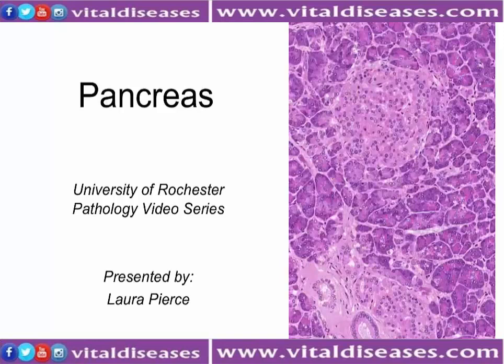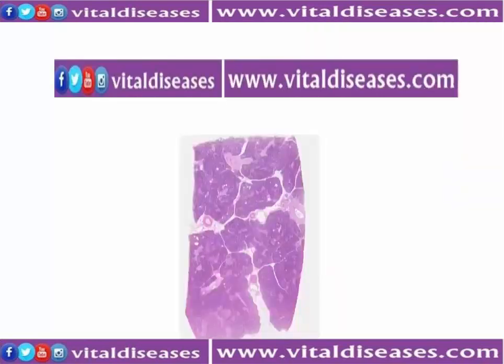This video reviews the normal histology of the pancreas. Using the NanoZoom digital pathology slides available in the U of R histology folder, we will examine the microscopic anatomy of the pancreas. Feel free to locate slide 66 and follow along as we explore the pancreas cross-section.